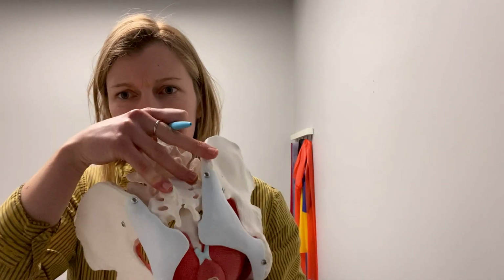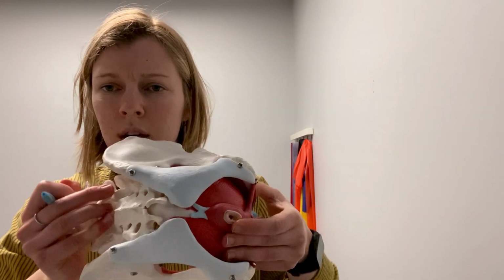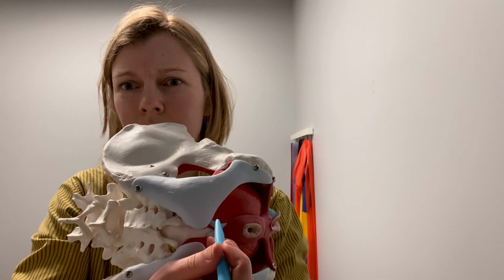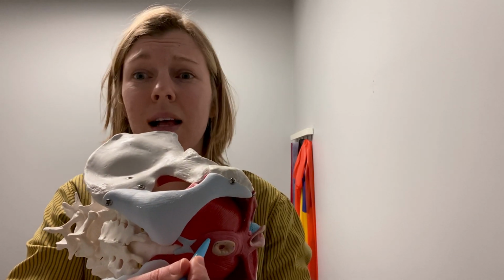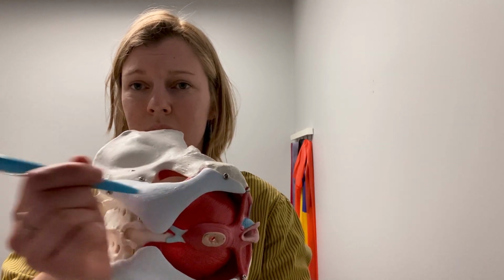Some fun ones we can do on the posterior pelvic floor, in a lying on your side position, often with one finger rectally. We can target the coccygeus muscle. One of my all-time favorites, we can target the puborectalis muscle, which can really help decrease any tension and tone in that muscle. And again, often a finger is inserted rectally and the needle's coming down this way.